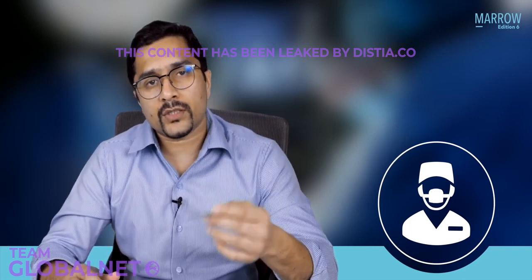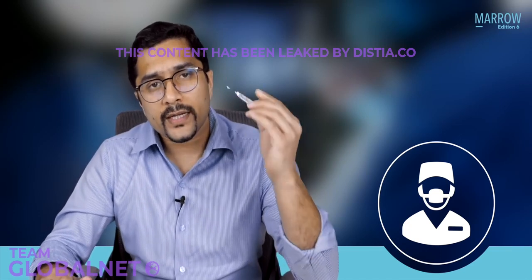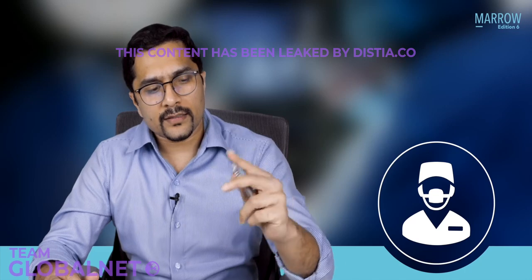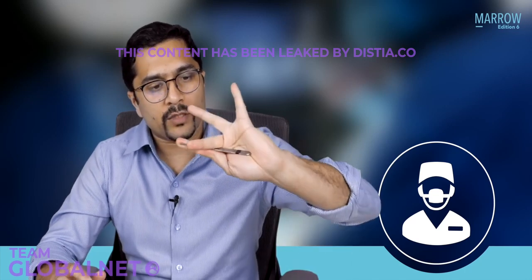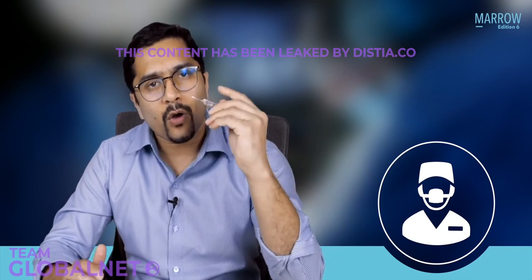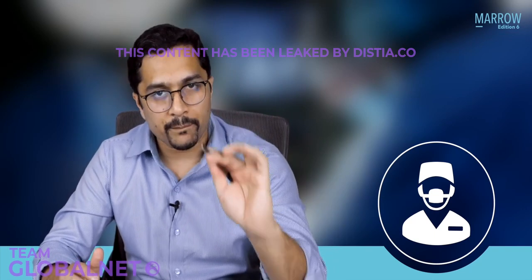So an examiner will ask you, how will you hold this? So you hold it like a pen. You hold it like a pen, right? Or another technique is to palm it, where you can hide it in your palm. That is another technique. But the more common technique is to hold it like a pen.